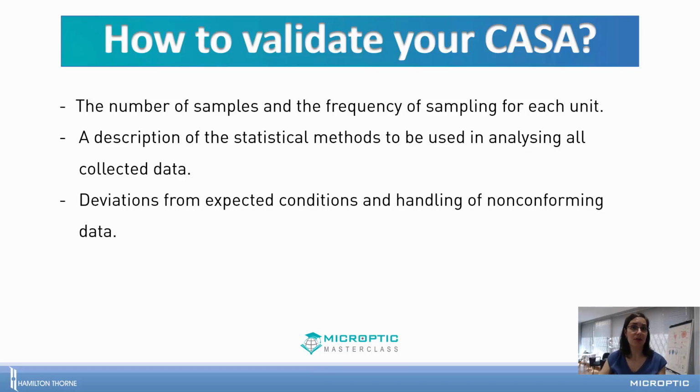So it's very important to define what statistical methods will be followed. And how can we handle deviations from expected conditions, or how to handle non-conforming data?